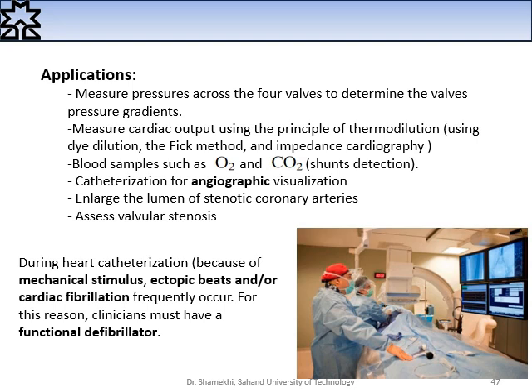Also, measuring the gases O2 and CO2 in blood samples for shunt detection. And also catheterization can be used for angiographic visualization.